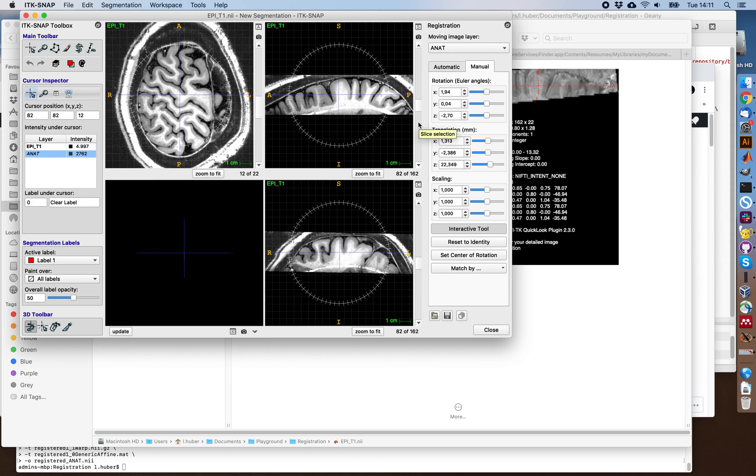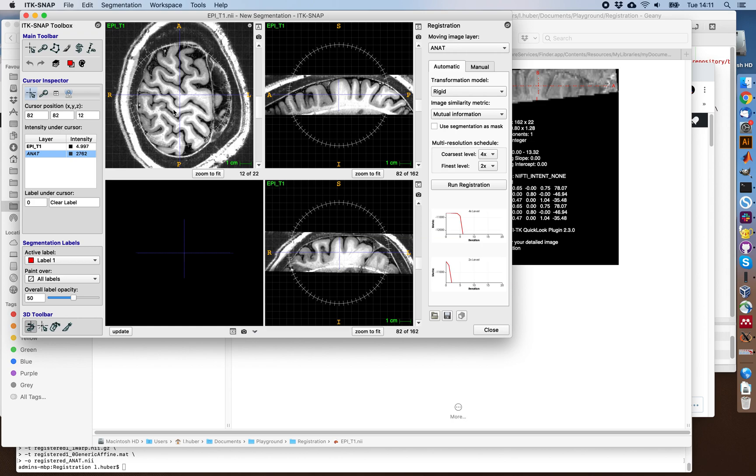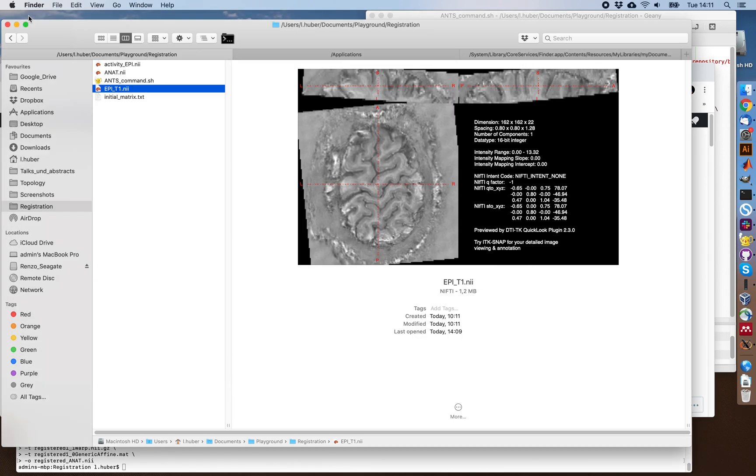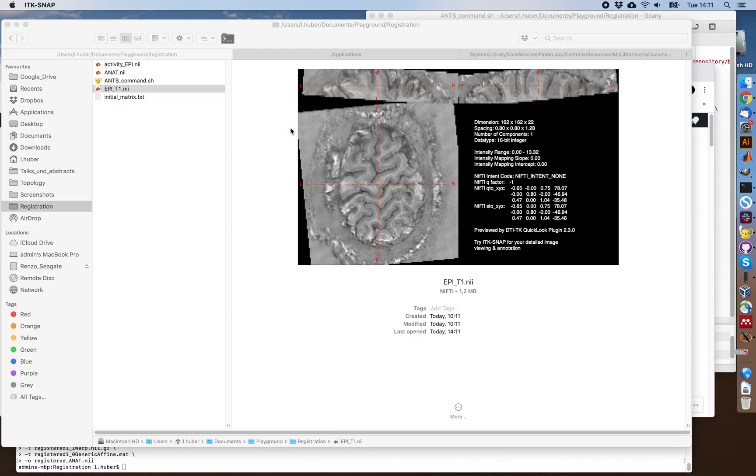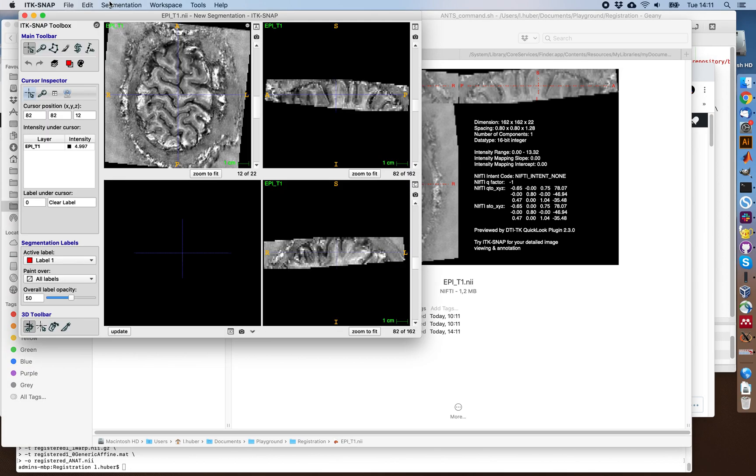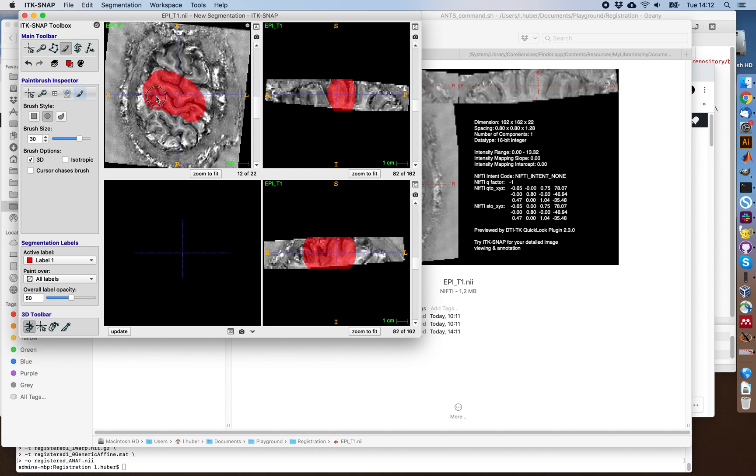Now, as we saw earlier, the automatic registration very often does not work. And this partly comes from the fact that it tries to align the entire volume, including the skin and everything. So it helps a lot to focus on a specific ROI only. And we can do that, for example, by opening it again and draw an ROI that we are interested in. For example, here using a 3D volume ROI and just roughly outlining here the motor cortex or the area that we want to focus our registration on.